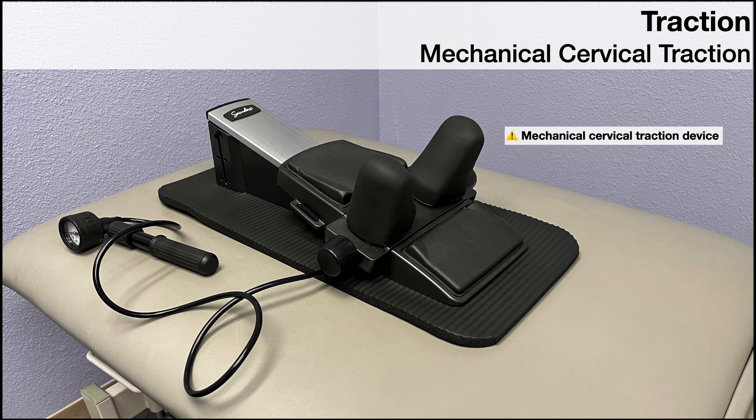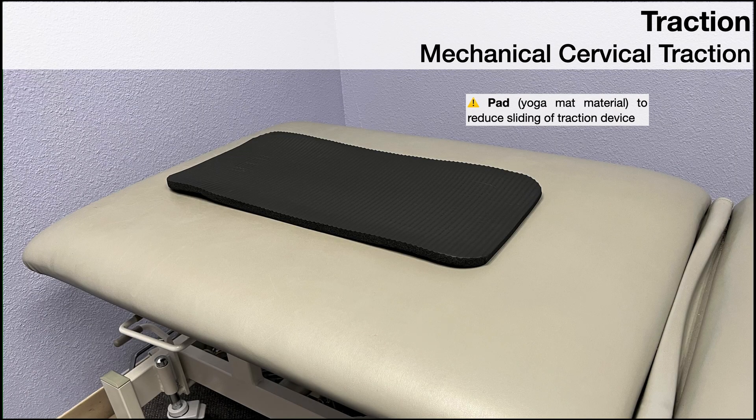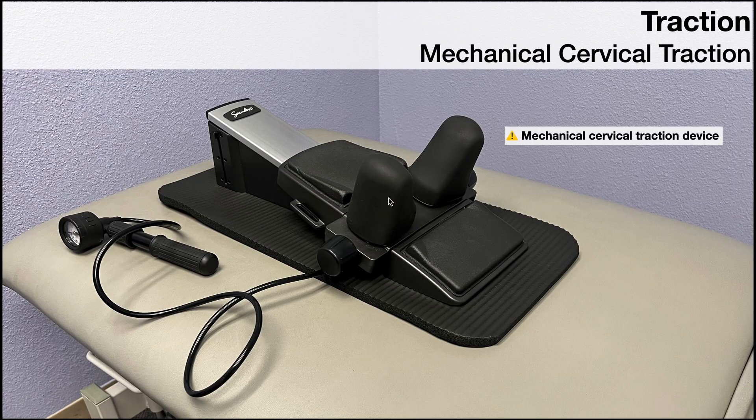In this video I'm going to show you how to set up and perform mechanical cervical traction. Before we start, here's a tip: this pad made out of yoga mat material sits on the treatment table underneath the traction device. On some surfaces the traction device can slide, and we don't want that to happen. This pad provides friction that prevents movement of the traction device.